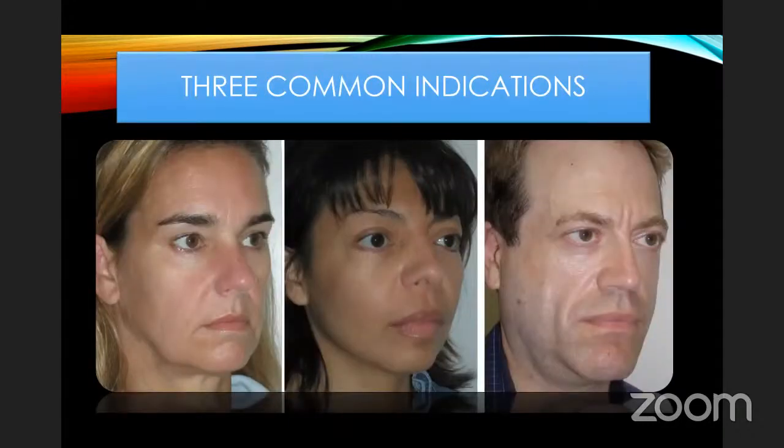So here are three different kinds of mid-face volume that we deal with. The patient on the left is your most typical situation where she has that submalar volume loss. So she would need a submalar implant. The patient in the center has pretty good submalar fill, but she could use lateral augmentation. And the patient on the right doesn't have anything, so he would benefit from zones 1, 2, and 3 that I showed you earlier. He needs augmentation everywhere.